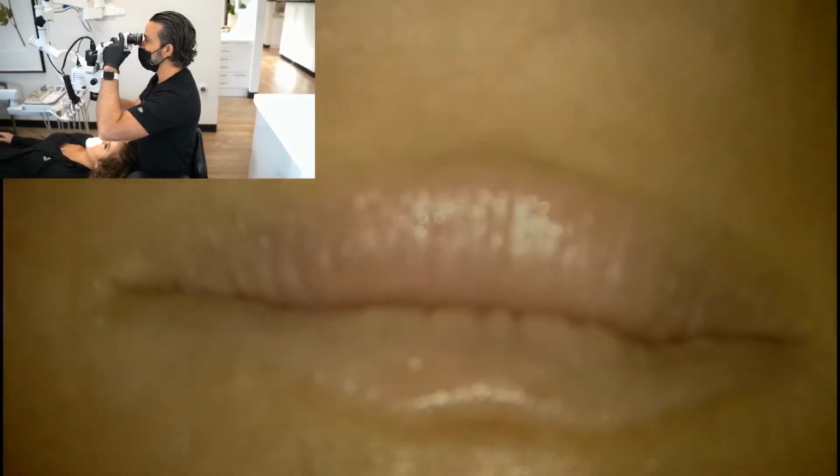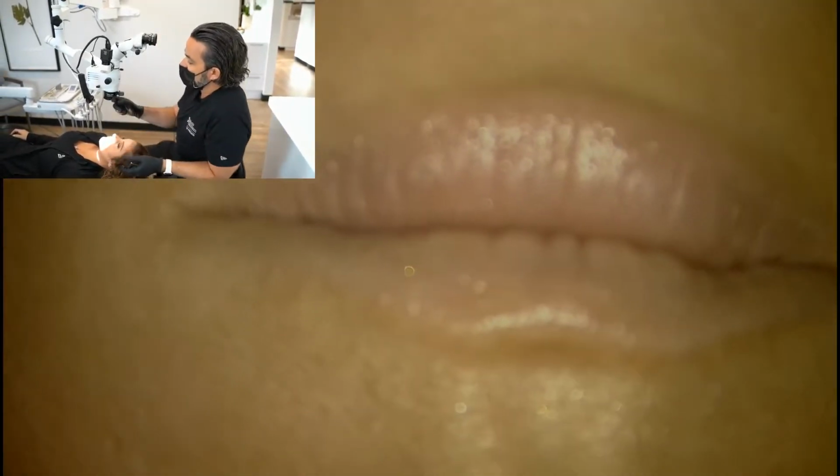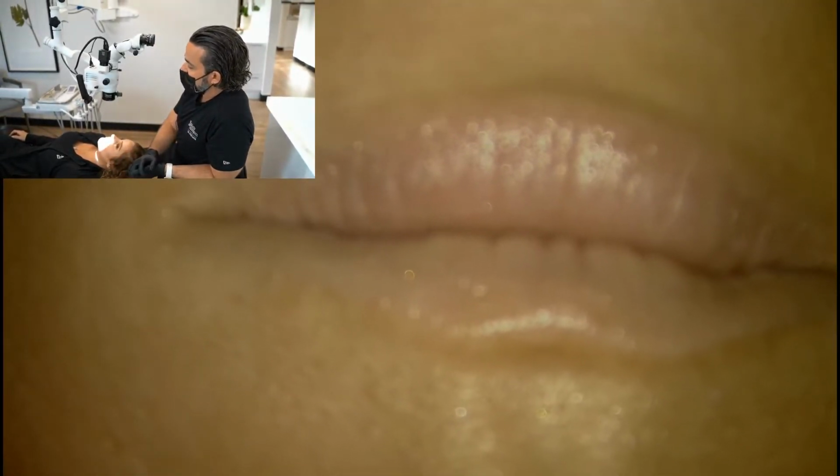And so I've learned to work, I'm only 5'9", but I've learned to work at a full 350 millimeters of working length here. Now it's a variable focus on this microscope, and so I can go from 200 to 350, and so there's a lot of play between practitioners. There's a lot of height that you can do if you have different people working in your operatory. And so that's one thing, is to get a varifocus lens.